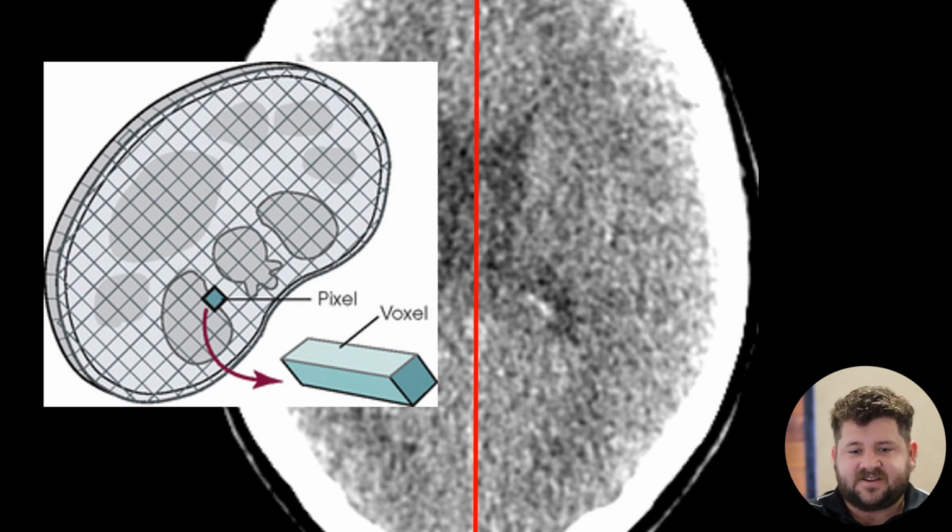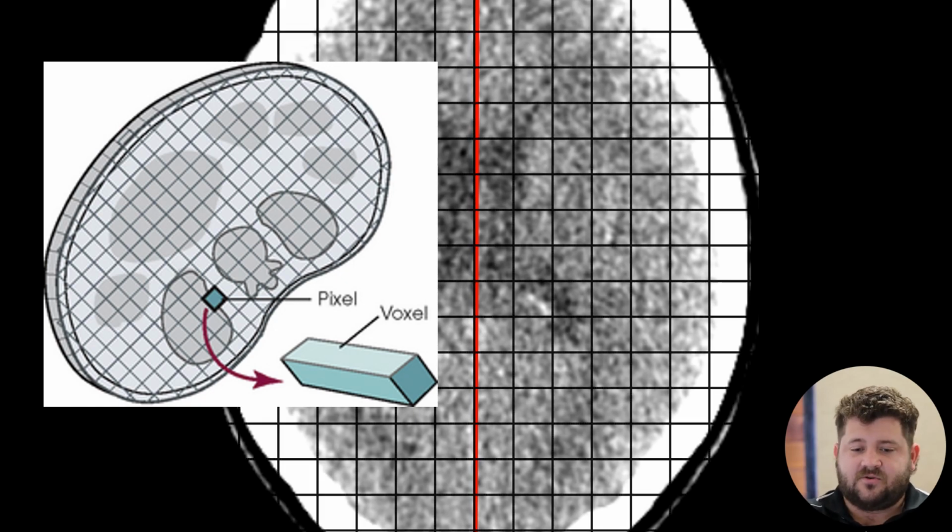So to do this, it creates an attenuation curve. So that's what we looked at in the last slide. And so it does this for each voxel of the brain and compares them across. So the software is doing a lot of calculations from a lot of scans really quickly. So it's pretty impressive that we actually get these maps generated within a couple of minutes.